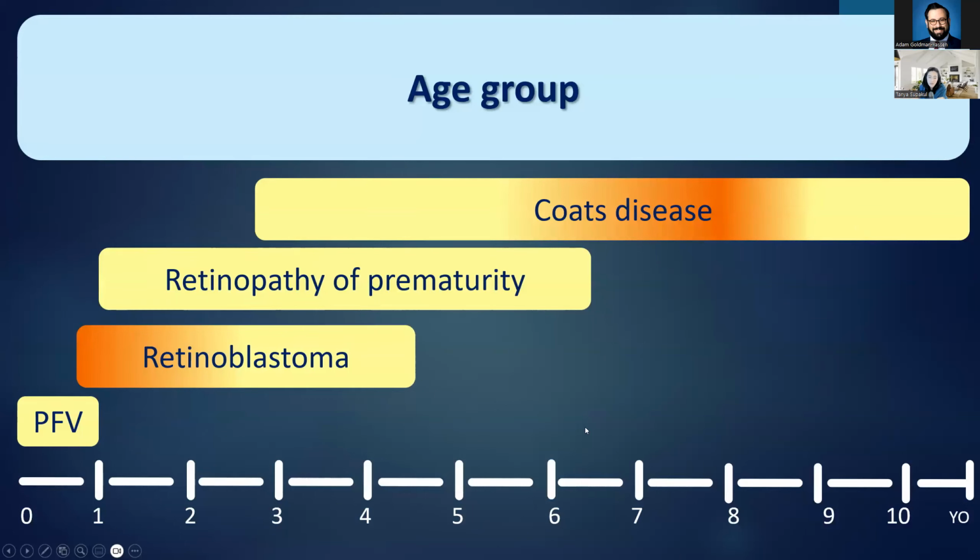If there are any questions, people can put them in the chat. Feel free. So for your protocol, do you have a specific retinoblastoma leukocoria protocol, or is this your general brain and orbits protocol for everybody? Oh, you have the same thing, right? So you're doing the small field of view, SWI and DWI only in these specific cases, or is that for all your orbits cases?